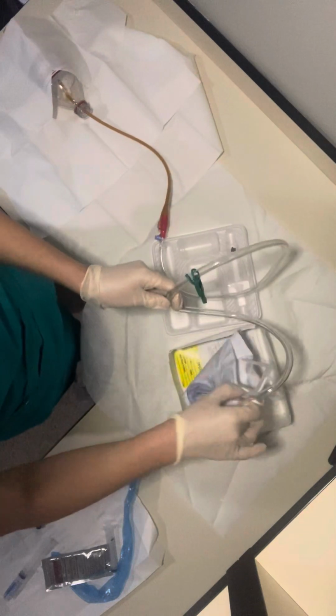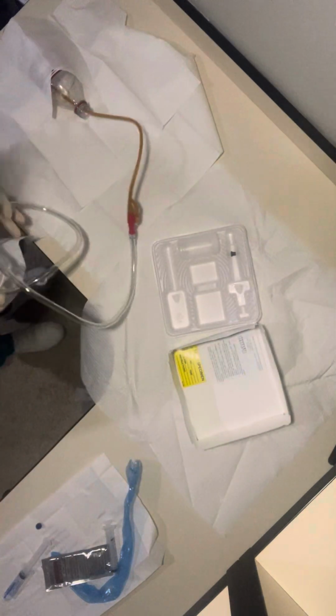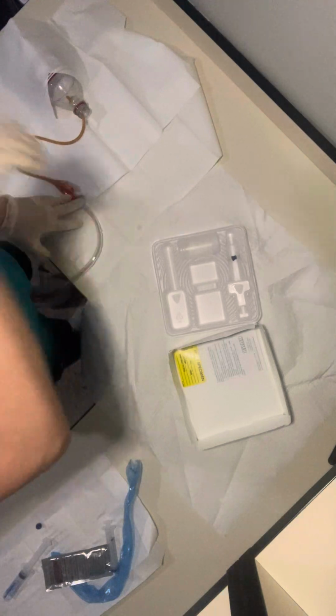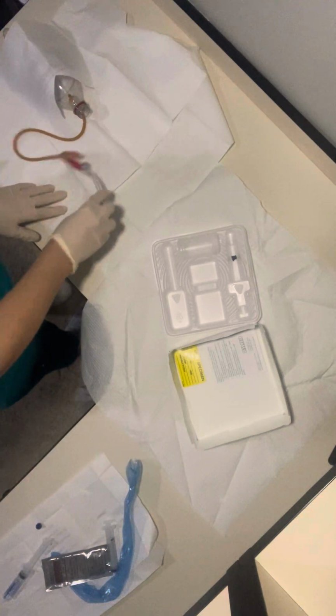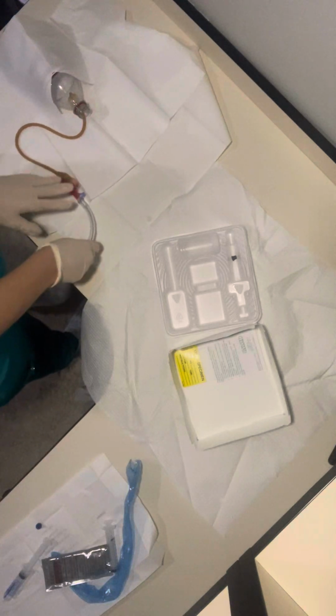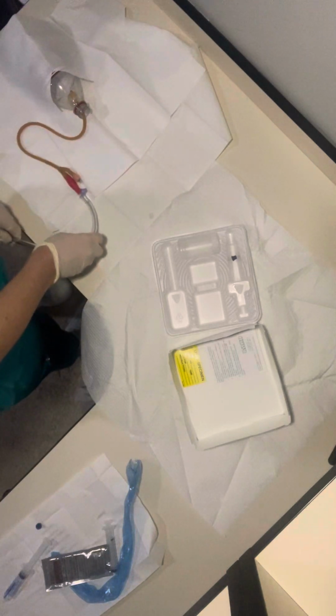So then you take your bag and you place your bag beside the bed, or on the side of the bed, but I don't have a place to hang it, so I'm just going to set it here. Make sure you have some slack for your patient, and then you can secure it. Okay.